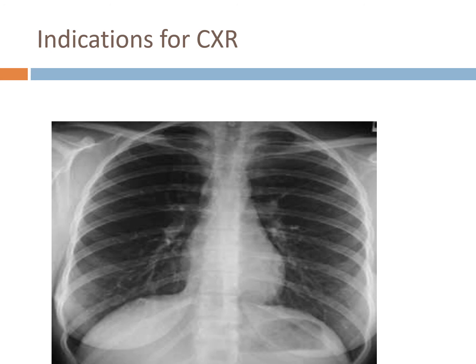Especially in the ICU, if there's an acute change going on, like you're doing your vent check and your airway pressures have gone up and your volumes have dropped, and you're listening to their lungs and you don't hear any breath sounds in the right upper lobe, and you've ruled out that they need to be suctioned, and you've checked your circuit and done everything else, it might be a good idea to get a chest X-ray.